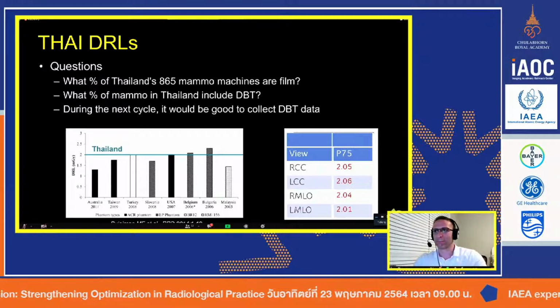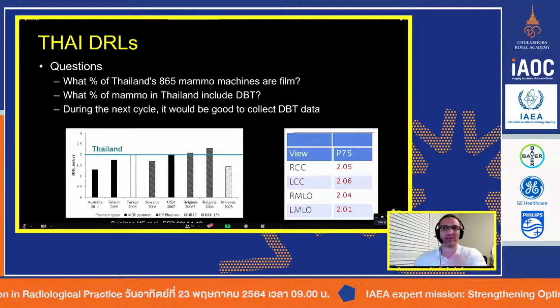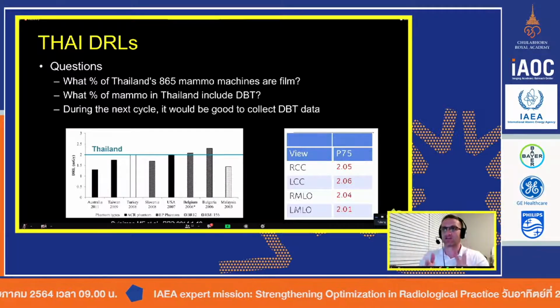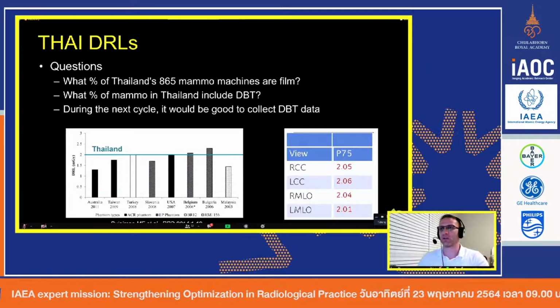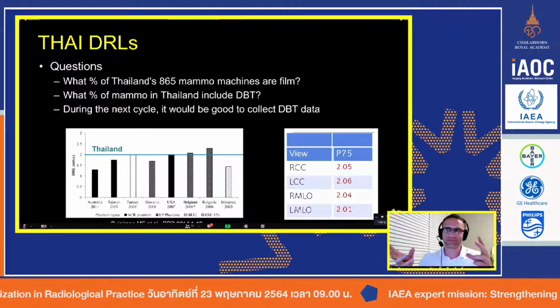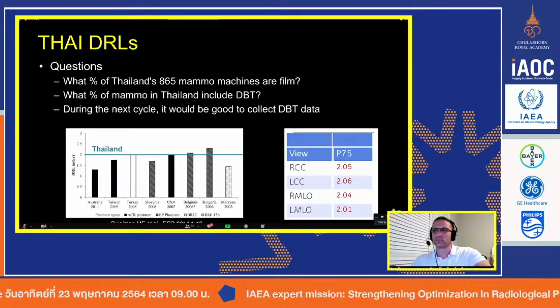Yes, okay. Yep. And then, I see. She talks about thickness, and so that's step 2. That's maybe step 3. That's kind of in the future, because once you've established what your national DRL is, whatever it is, I think this would probably be 5 centimeters. Going forward, you get more and more data. Now you can start to figure out where a 3 centimeter or an 8 centimeter breast would fit on the spectrum. So it's like a national DRL for breast on each view. Yeah, best place to start.